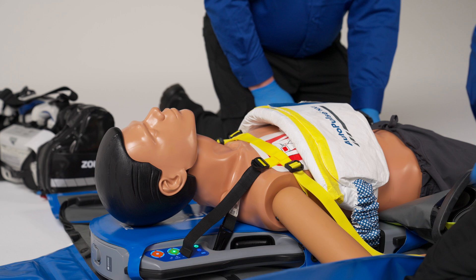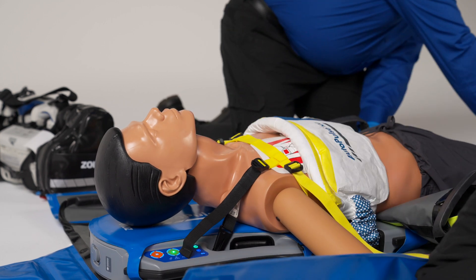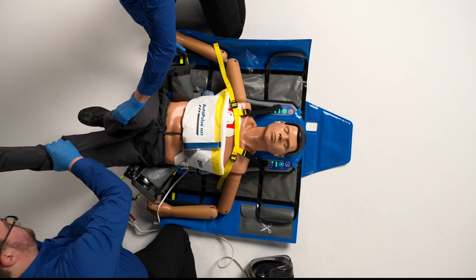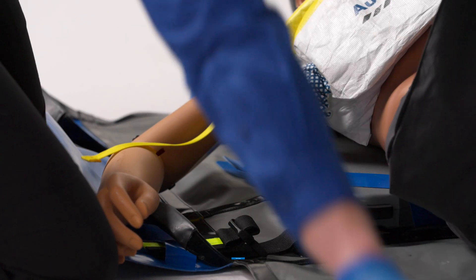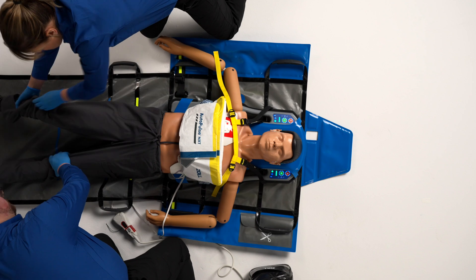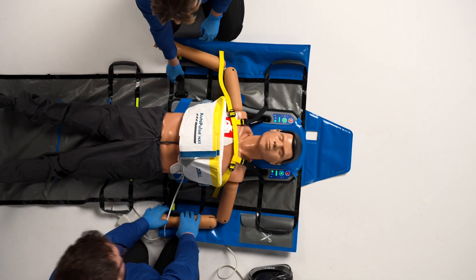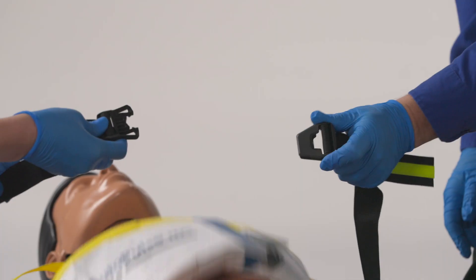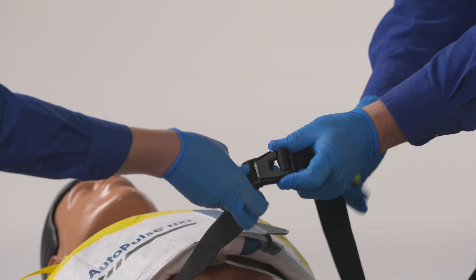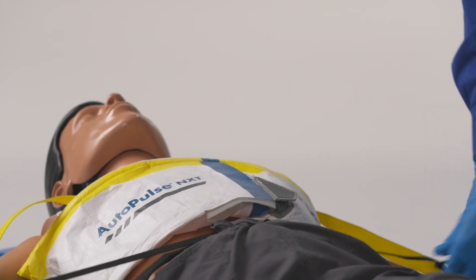After securing the patient to the platform with the shoulder restraint, lift the lower extremities of the patient. Using the yellow handles, deploy the lower gray portion of the Quick Case Carry Sheet. The waist belt straps are located on either side of the patient. Securely connect these over the patient's waist. Ensure that the waist belt is secure enough to stabilize the patient without compressing the stomach.